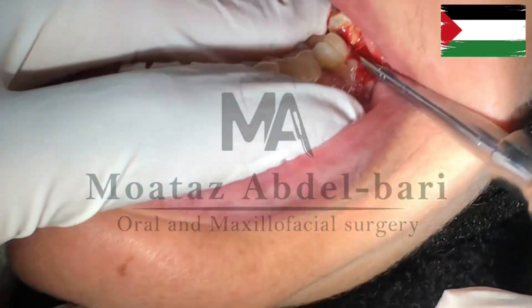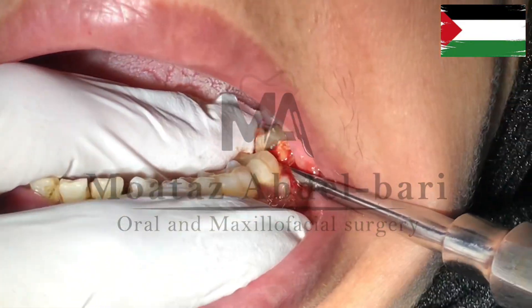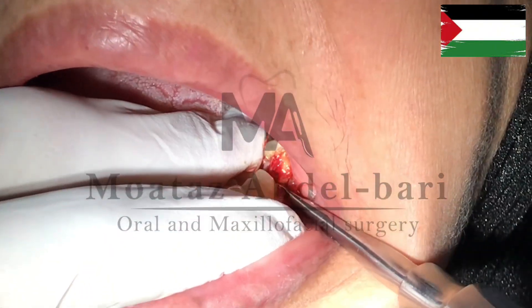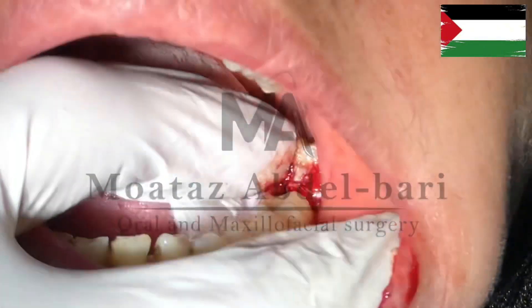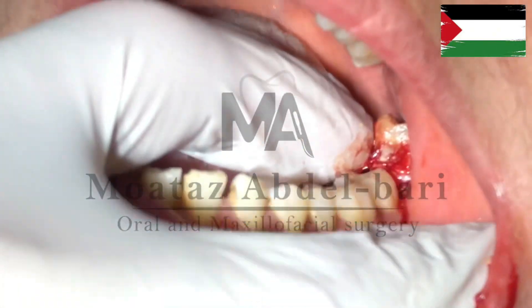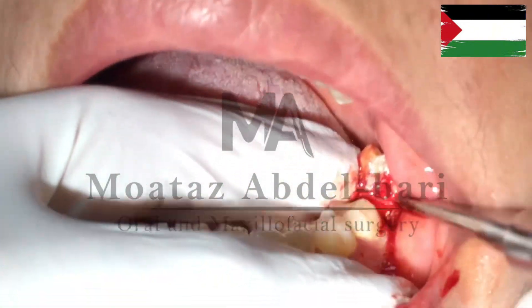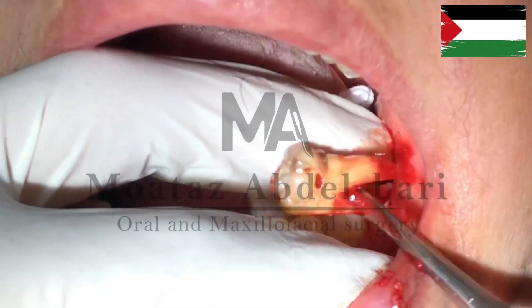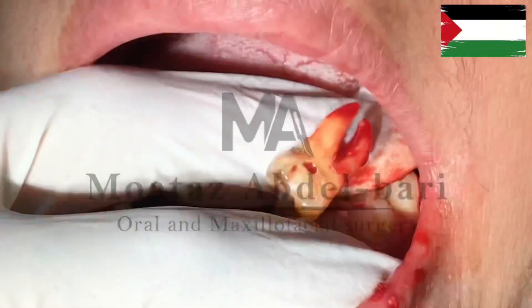This video highlights the tip and trick to assess the maximum range of leverage. As you see now, the tooth is lifted from the socket, but the vertical well-defined external oblique ridge interferes with its full extraction. For this reason, take the maximum range as a fulcrum and deliver the tooth one or two millimeters like this, until the tooth is fully extracted — confirming our initial suspicion that it is indeed multi-rooted.